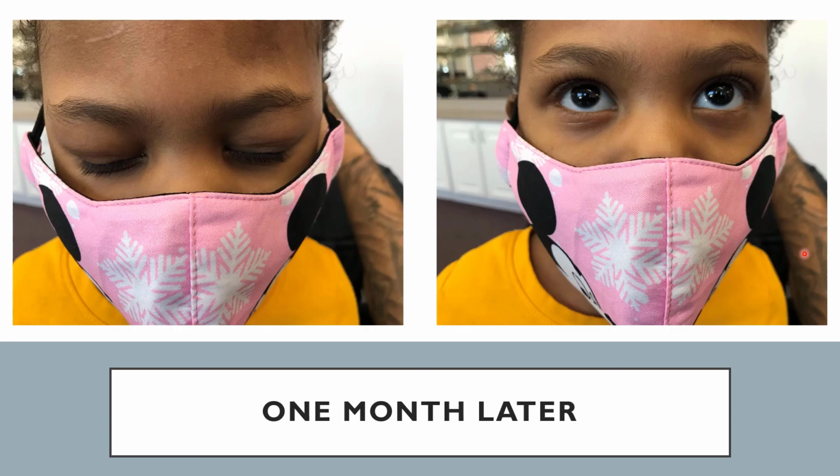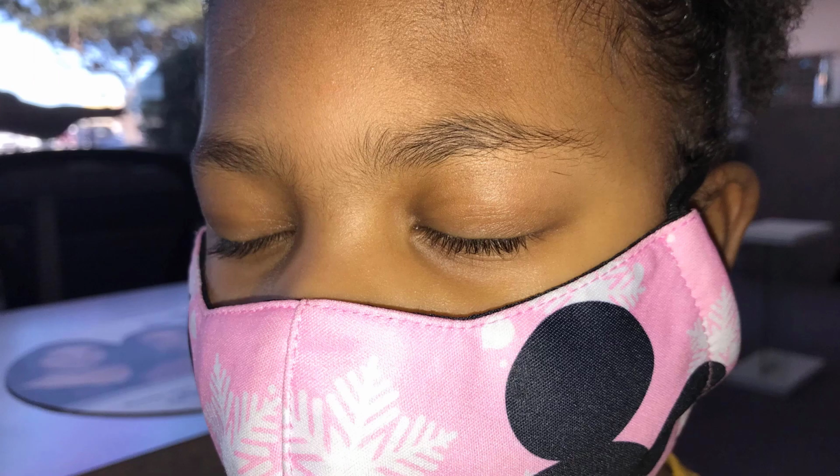Okay. Actually, that was the last visit. Then my protocol is you do the treatment, whatever number of sessions you're going to do, and you cut them loose for a month and you leave them alone, because you get downstream effects. All the signaling pathways, all that stuff is still going on days and days and weeks after the exposure to the light. So here this little girl is 1 month later. It's almost gone. It's gone. That bad boy is gone.